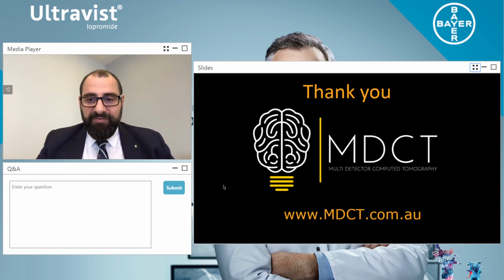And now we have another question. Madhuri Sahu, is MRI or CT better to differentiate lesions? Again, I think I've answered that question, but I'd love to answer it again. It's not which modality is better, it's which contrast media is better. So if you have MRI and you're using extracellular gadolinium, well, it's fine. But if you use the Primovist or Eovist, depending which part of the world it's called, it's a hepatocellular specific contrast. And so that's where the beauty of that is.